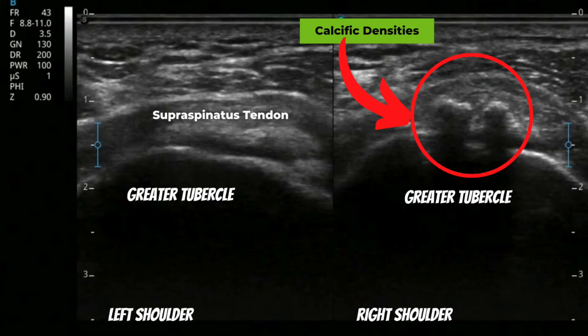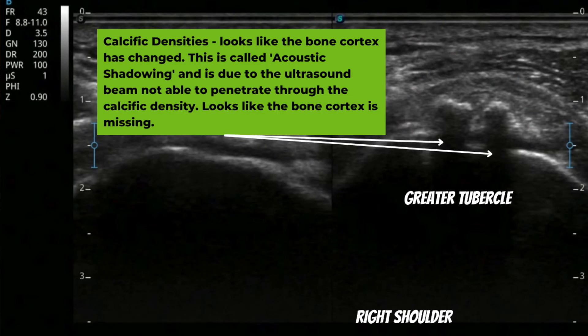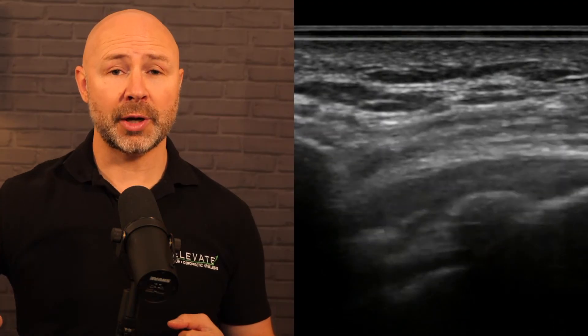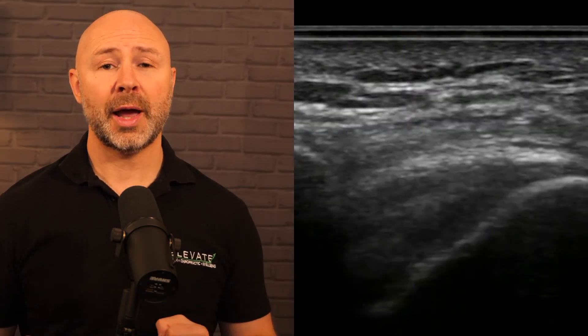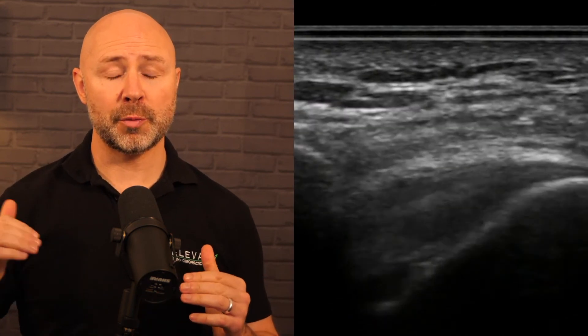The subscapularis and infraspinatus were absolutely fine, but as soon as we looked at the supraspinatus, we saw obvious signs of calcific tendinopathy with calcific deposits within the tendon. On dynamic imaging — keeping the probe on the patient while they perform movement — going into abduction you can see a small calcific density move between the humerus and the acromion; that's as far as the client could get. As that calcific density tries to pass between those two surfaces, the pinch occurs. Because this has been ongoing, the tendon has become irritated and swollen, making the problem worse — the canal size hasn't increased, but the tendon has, making it increasingly painful to repeat that movement.